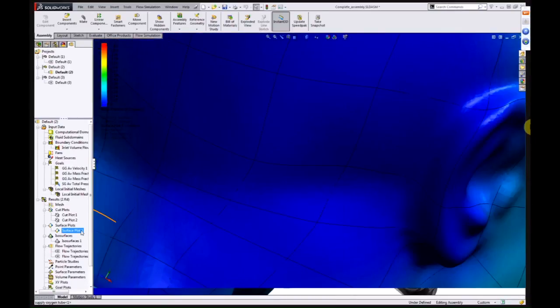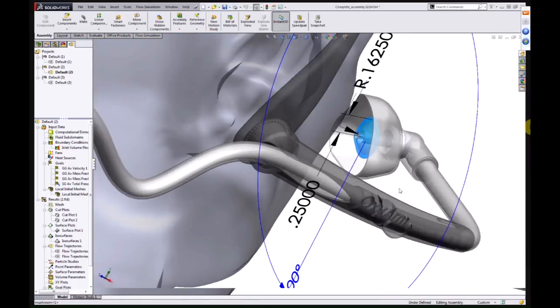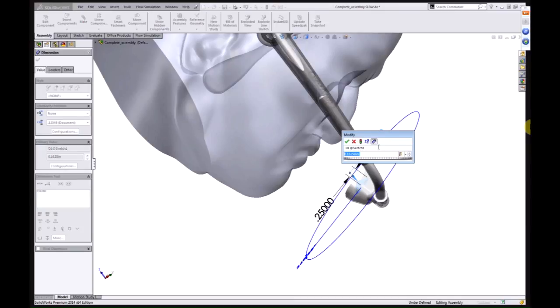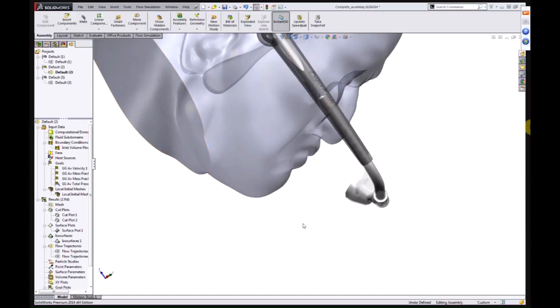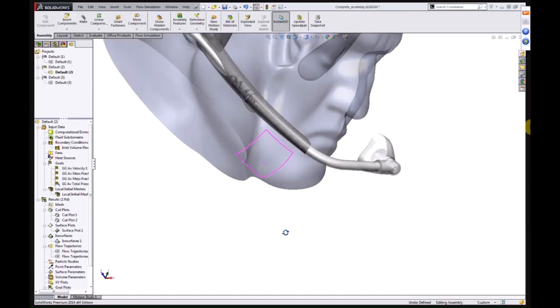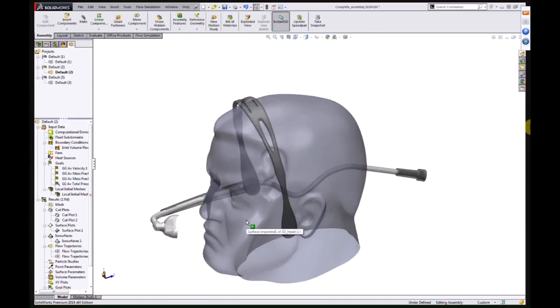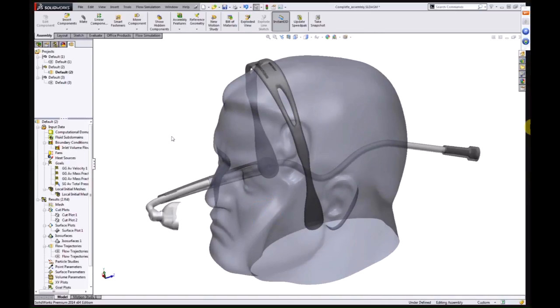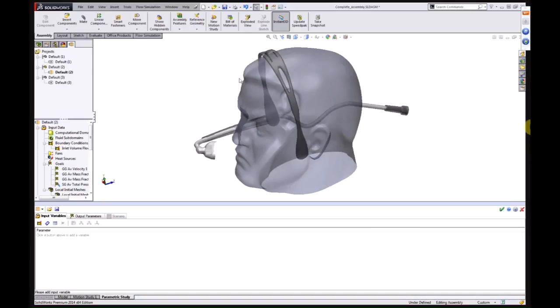Now, we can also automate that process a little bit. Flow simulation has parametric analysis capability. And so it enables us to go to something called a parametric study and identify some parameters we might want to change. So I could identify the angle of this as a parameter of interest, the offset as a parameter of interest, and I could run a batch of analyses based on different variations of these factors. And in fact, the makers of Oxyarm did this.